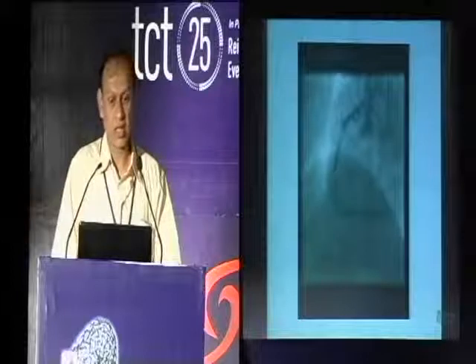So one example where, in a very proximal location of the guiding catheter, you need to sit outside the vessel and then wire the vessel sitting outside, not to engage the guiding catheter deep, and then it can be done with the procedure, staying outside the ostium of the coronary artery.